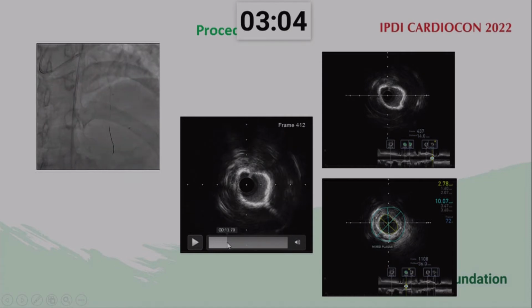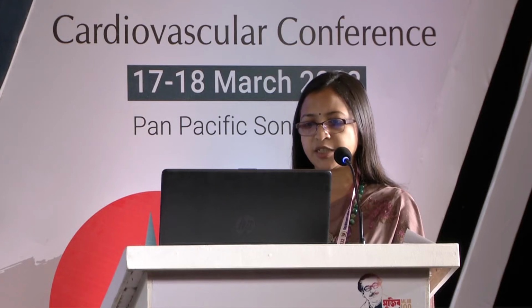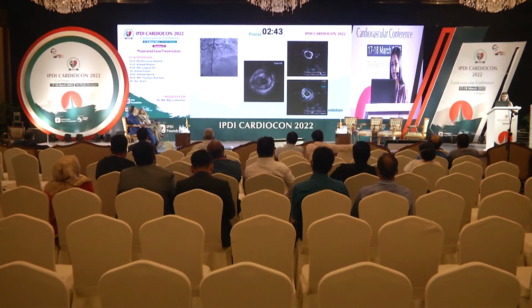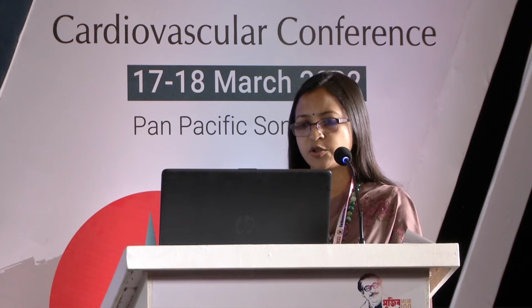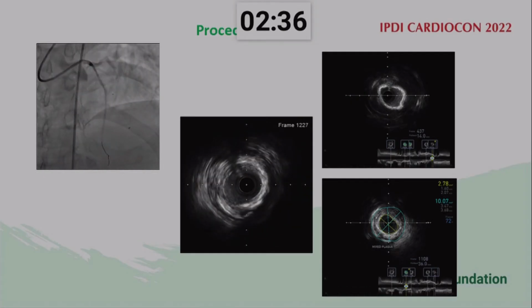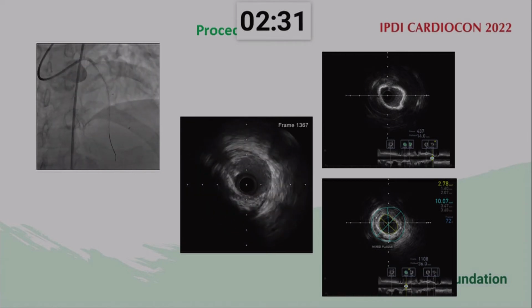almost 360-degree calcium arc in the lesion, and the calcium is thick. There is almost no reverberation, with acoustic shadowing just behind the calcium. This is all IVUS evidence of thick calcium. And there is also an ostial lesion in the LAD that was underappreciated in the angiogram. So with this IVUS, we decided to treat the lesion with rota and put a stent covering the LAD ostium.